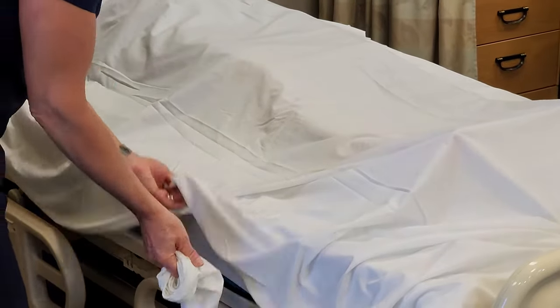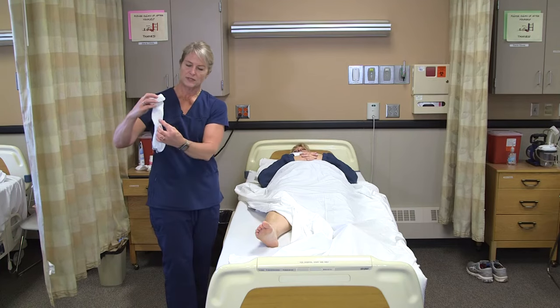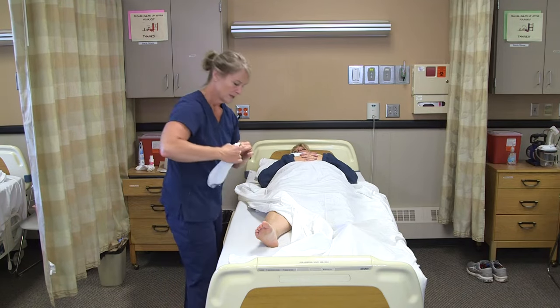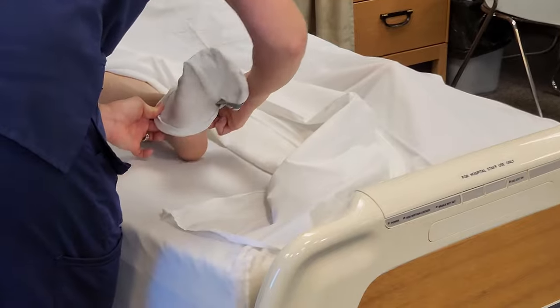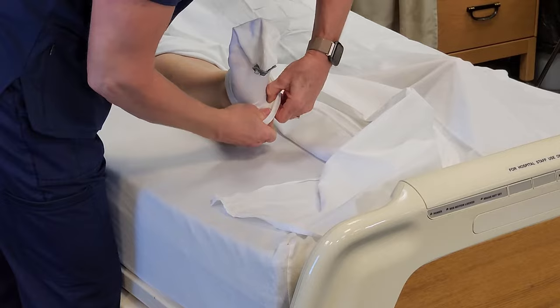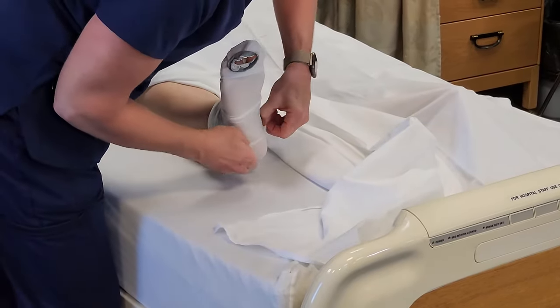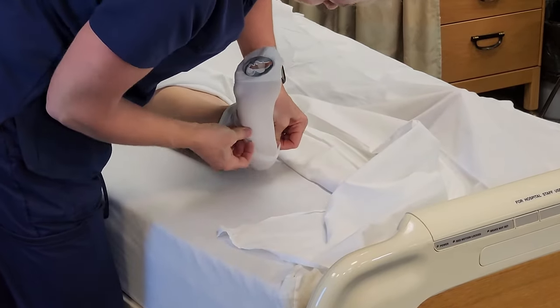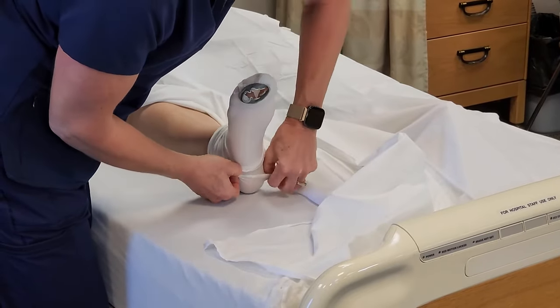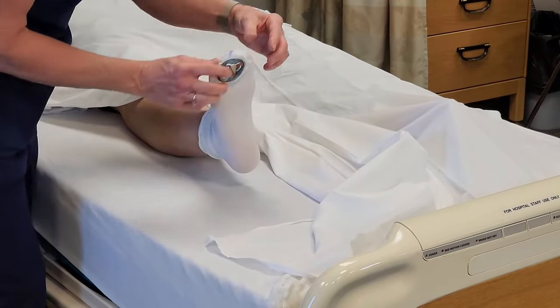I'm just going to get your leg out here if that's okay, Annie. I'm going to make sure the heel is on the back side, so I'm going to stretch that again and check that the heel is in the right place. I'm going to put that over her foot and get it on just to where that heel marker is. Once I get it up her leg it will be very difficult to turn or readjust, so I check now. I can see the square right around her heel.